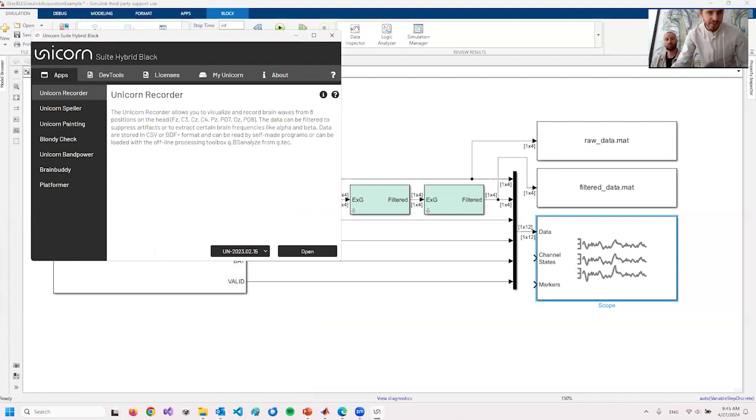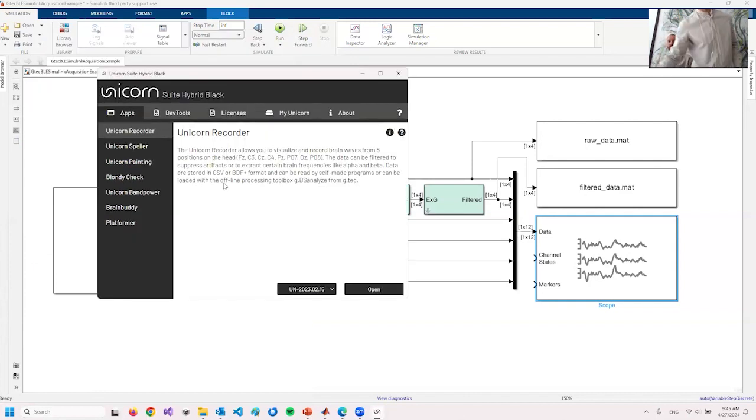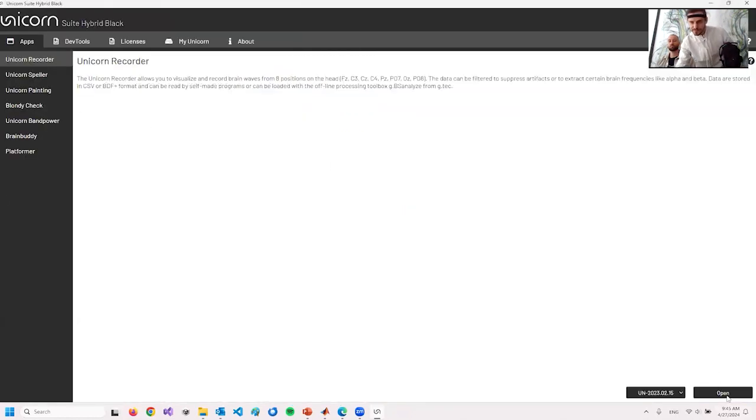So I just opened the Unicorn Suite. This is the software framework that we use on Windows systems for the Unicorn environment. And first of all, I'd like to show you the same demo that I did in Simulink right now using the Unicorn Recorder. In the Unicorn Recorder, we can visualize EEG data, we can apply simple pre-processing to the EEG, and therefore I first turn on the device and open the recorder application.